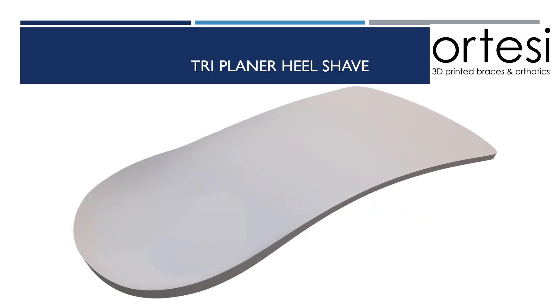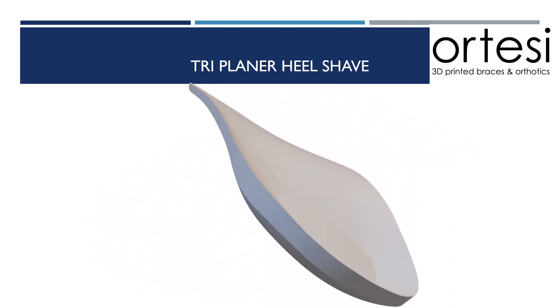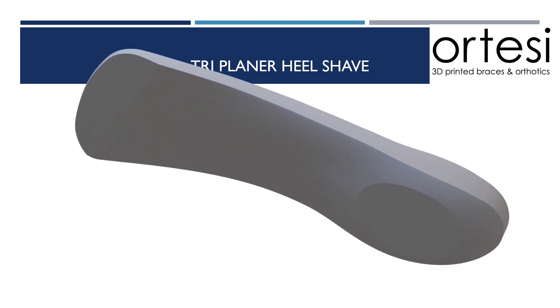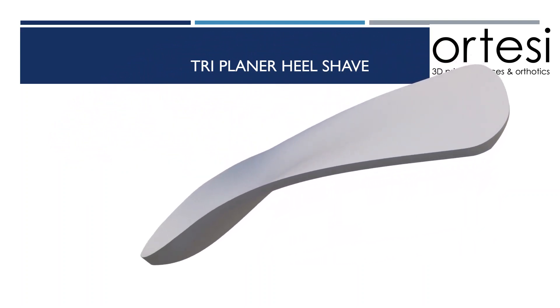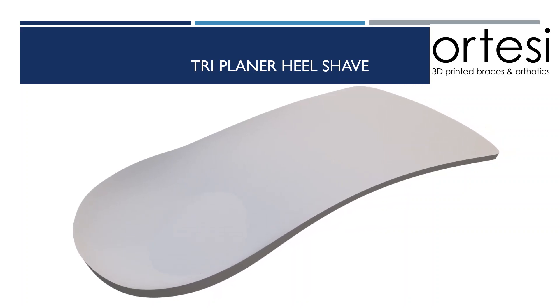A triplanar heel shave is similar to a medial heel scyve, however it is slightly larger and sits more anterior. Due to that slightly anterior placement, it can also produce some correction within the sagittal plane as well. A triplanar heel shave is a modification that's useful in a patient with a medially deviated subtalar joint axis where you would like to increase the rear foot correction.